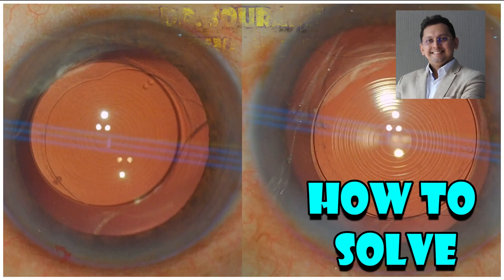In this video, I will be discussing a case of post-toric IOL refractive error and how to solve this issue.